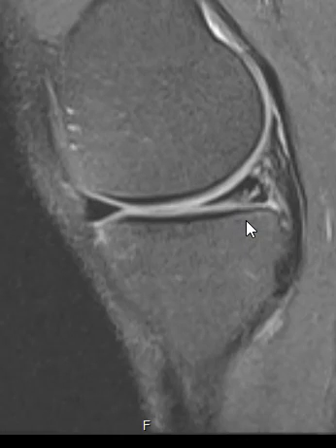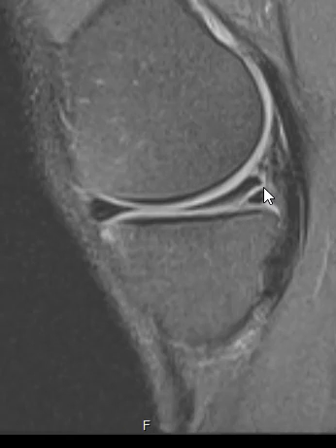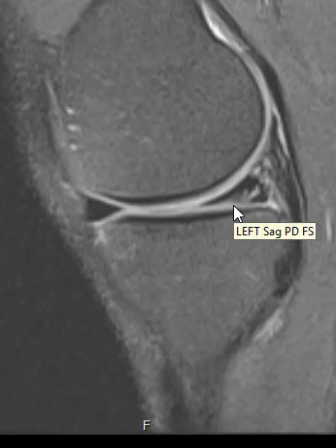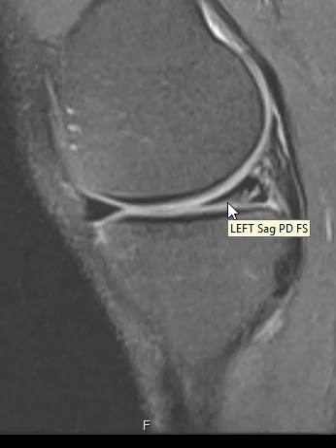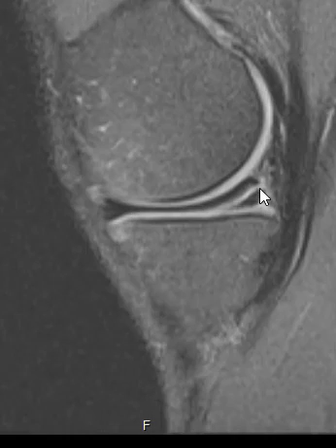The meniscus has three components: the inner component, the middle component, and the outer or peripheral component. This one looks like it comes through the outer component and touches the undersurface in the middle, and maybe even to the inner third. I would call this a middle and peripheral third tear — an oblique undersurface tear.